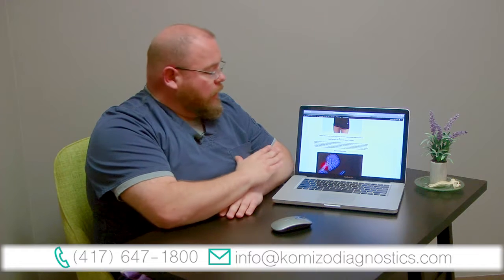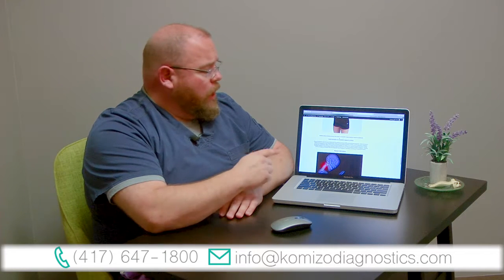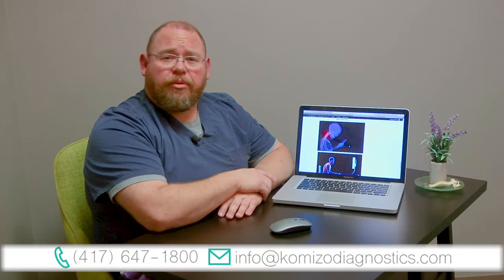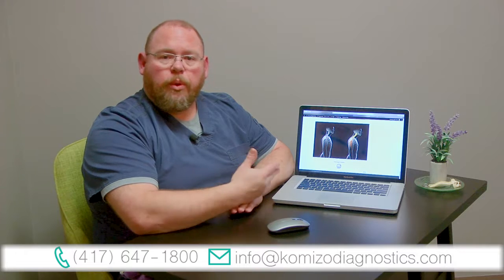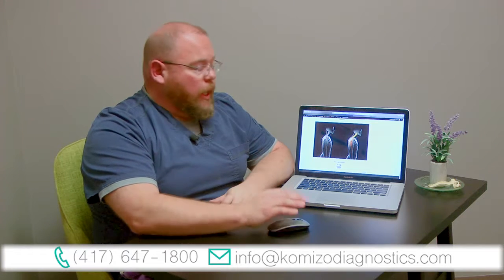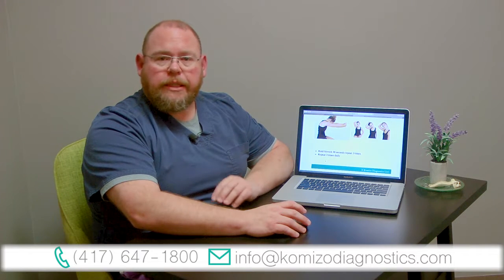I also added a clinical correlation to understand a little bit more about what may be triggering that type of muscle issue, as well as the educational tool to tell the patient, don't do these certain things to help speed your recovery. There's also a link to Wikipedia if you want to learn more about that specific muscle group as a reference, and below that is a print icon. The print icon brings up the stretches that you would prescribe specifically for that muscle referral that they selected.